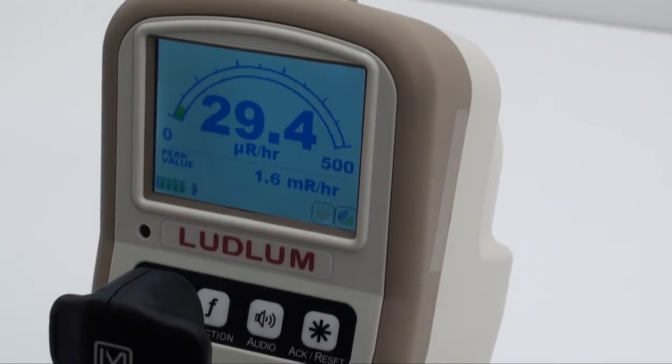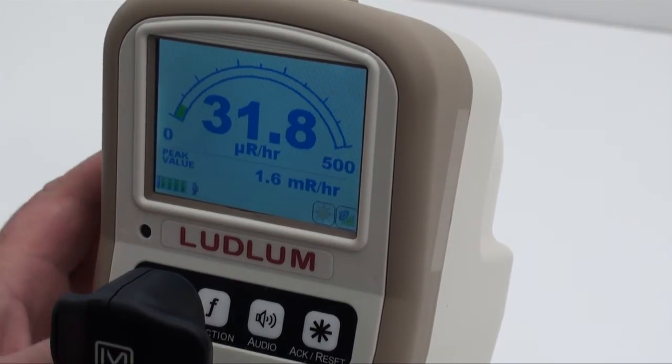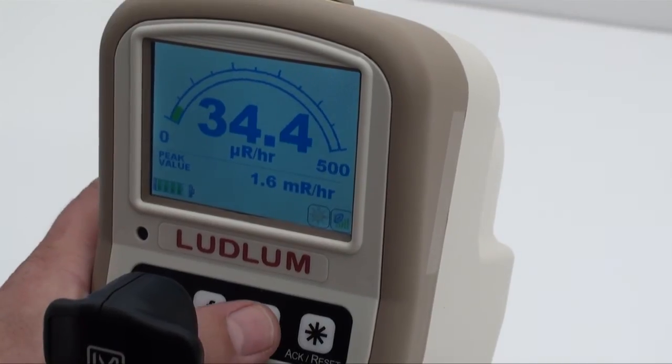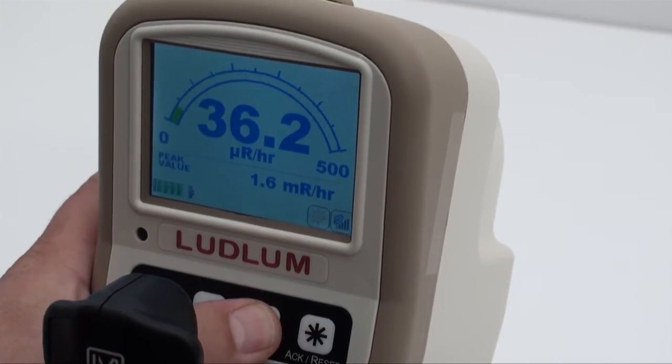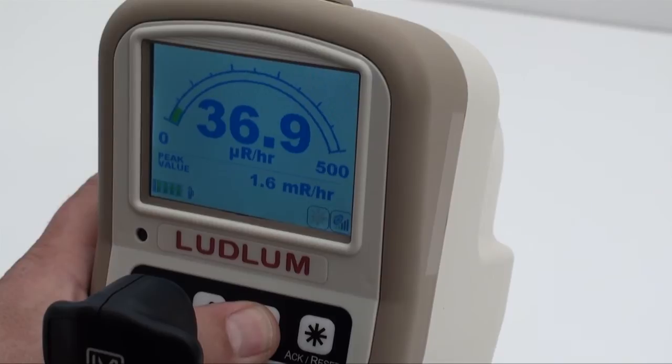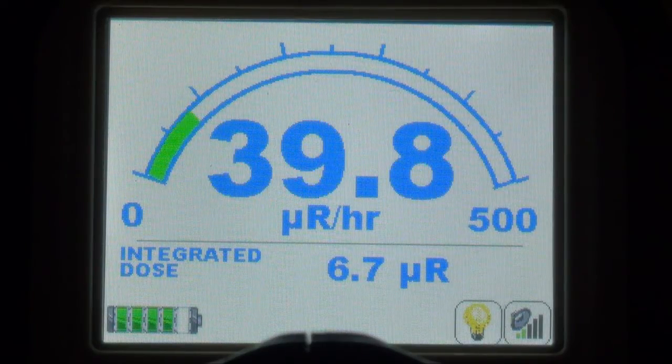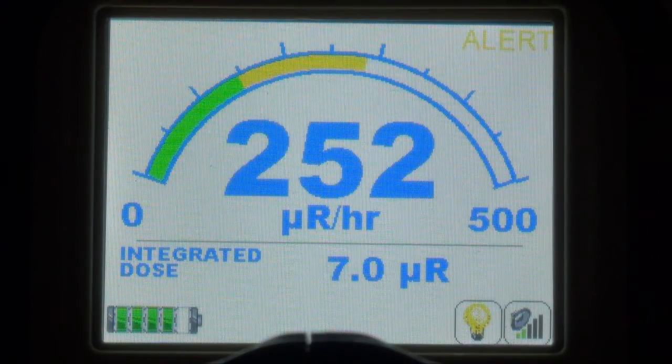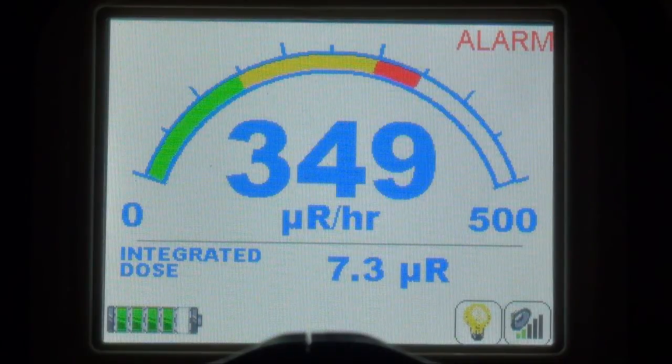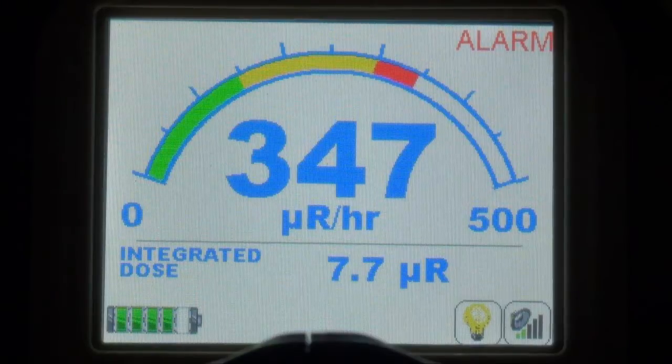Unlike most ion chambers, the model 9DP can output clicking sounds proportional to the radiation rate being measured. The audible output level is controlled by the operator. The instrument can be programmed with two levels of radiation alarms and are easily acknowledged by pressing the acknowledge button. Other non-programmable alarms include low battery and various detector failures.